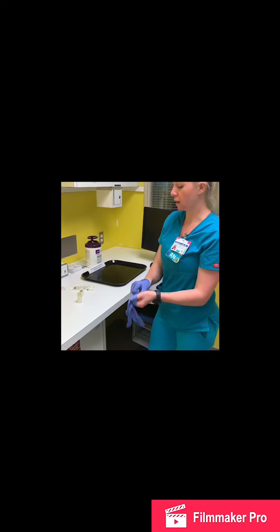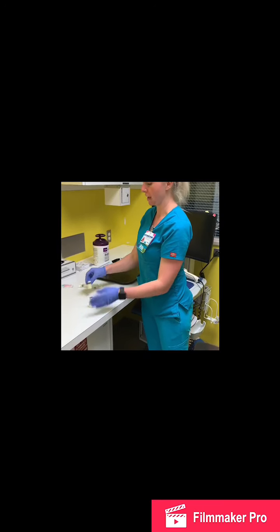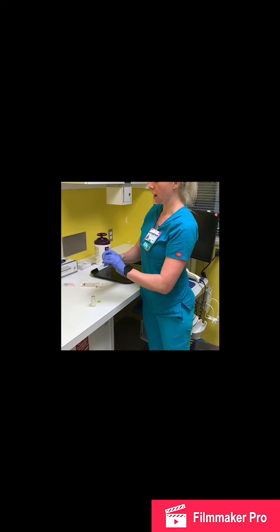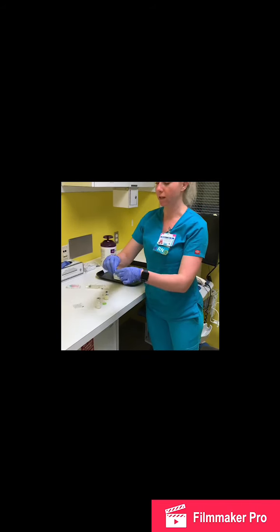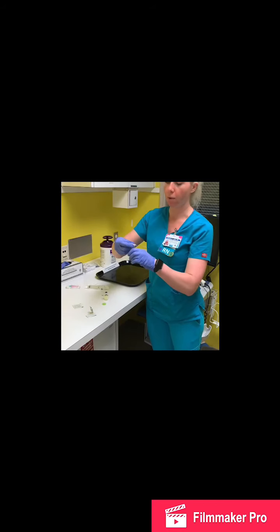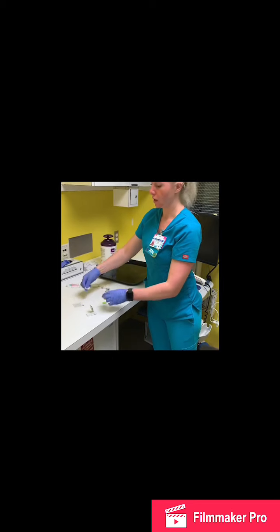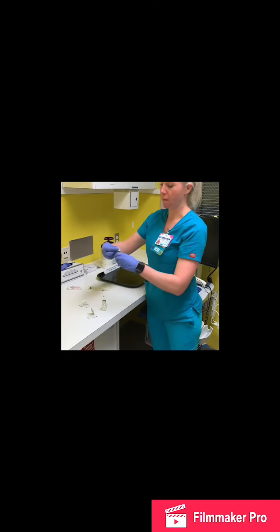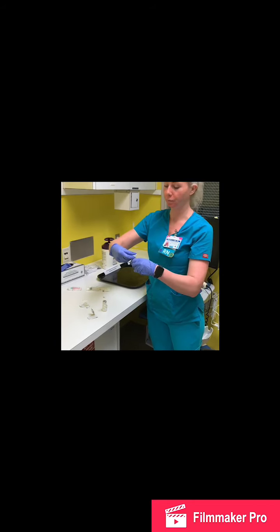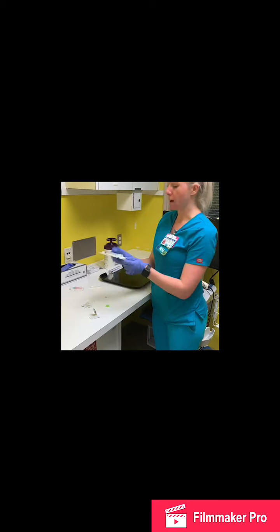So the first thing I'll do here is pop the tops off of both of the medication and the diluent. I'm then going to take 2 separate alcohol pads and I'm going to clean off the tops of both the diluent, scrubbing for 10 seconds, and also the medication with a separate alcohol pad. I'm going to leave those to dry and then I'll get my syringe ready.